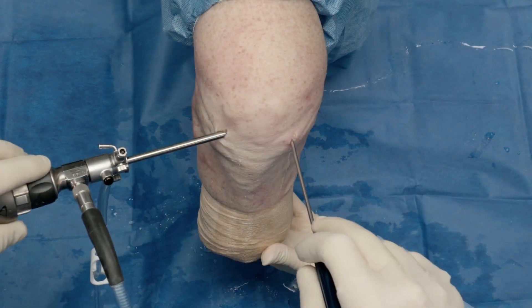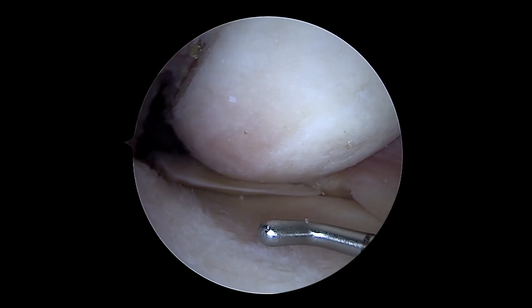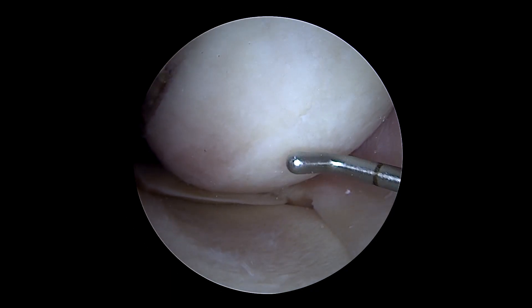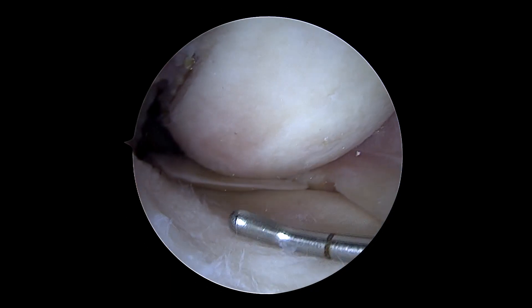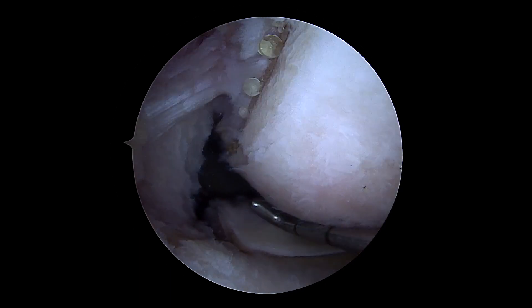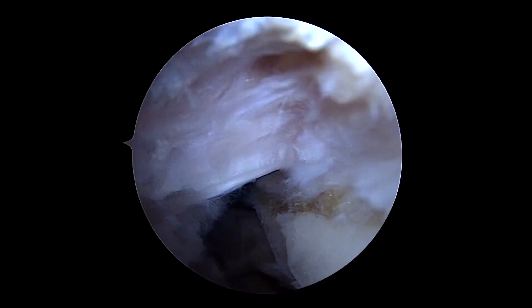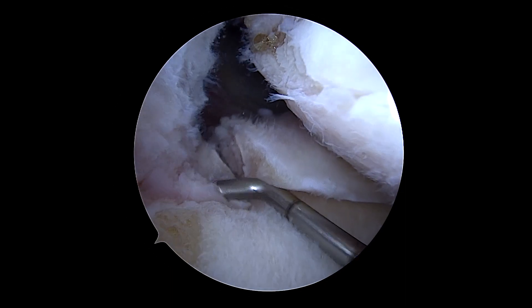We have a right knee here and we're looking through standard portals. We have our camera in the anterolateral portal and a probe through the anteromedial portal. This is probably a typical root patient — you can see some chondral damage of the condyle and the tibia, and then at the meniscus you can see a medial meniscus root. This is a radial tear near the root that we've created in this cadaveric specimen.